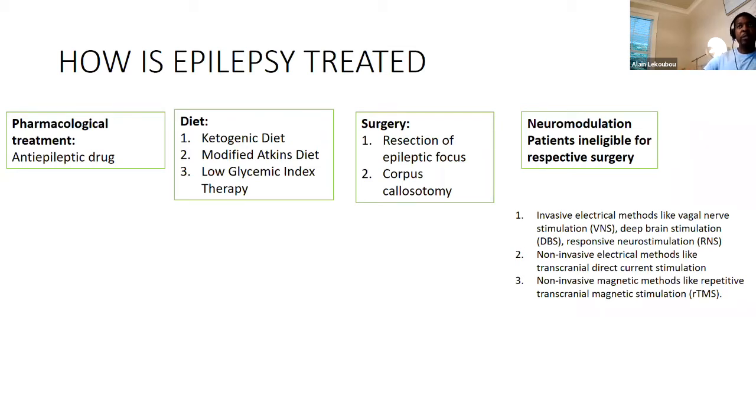It's like someone starts pouring water from the tap, and then water starts draining, and you see water somewhere on the road. If you try to cut the water from running on the road, you won't stop the water from flowing. You have to go back to the source and shut off the tap. Okay, that's key. And that is why we do stereo EEG.